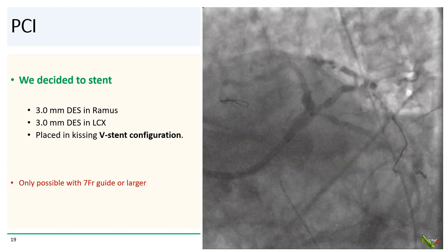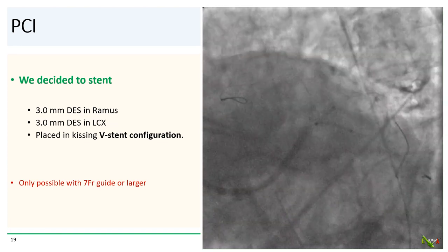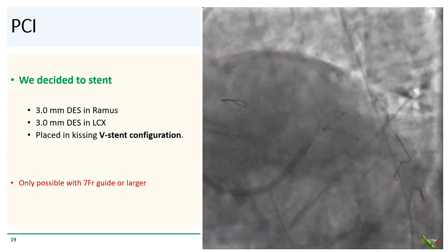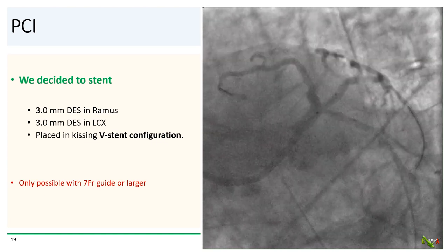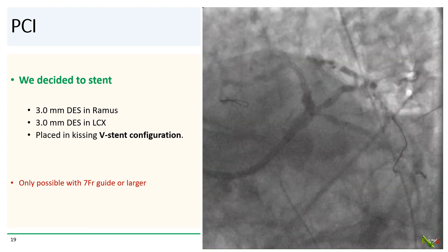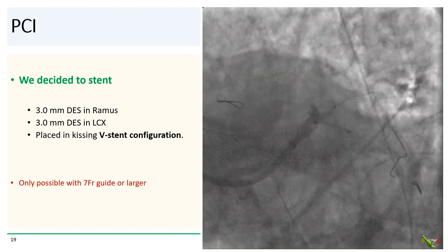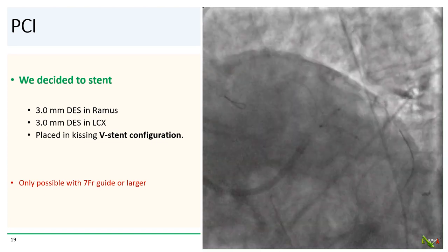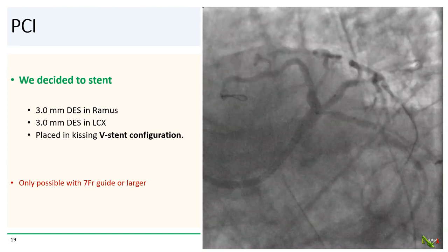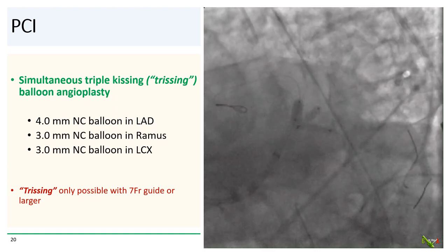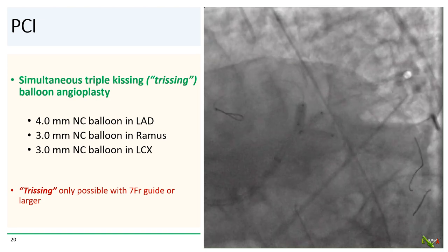Now, outside of emergencies, simultaneous kissing stents is definitely not my favorite strategy because it usually leads to a large stent neocarina that makes future PCI very difficult. However, in this scenario it seemed reasonable, especially since the neocarina will be minimized in the V-stent configuration. Remember that kissing stents is only possible with 7 French guides or larger — in this case, we had upsized to an 8 French system. We then post-dilated using simultaneous triple kissing balloon angioplasty, also known as trissing. Trissing is only possible with larger guides.